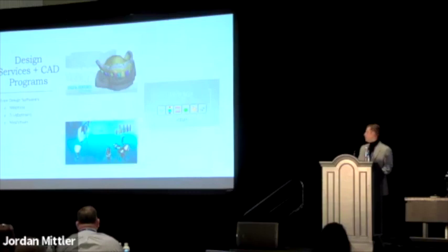Okay. There are also a whole bunch of free design services. These are some that I've played around with and are really good, especially maybe in the beginning when you're first playing with CAD stuff. The Medit programs are really great and they're free. It doesn't matter if you have a Medit software or not, a Medit scanner. You take your intraoral scan from any scanner and put it in there.